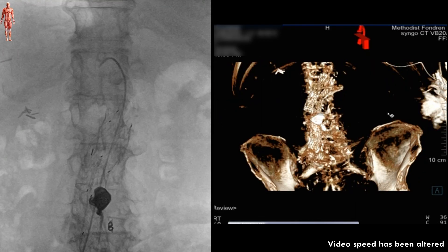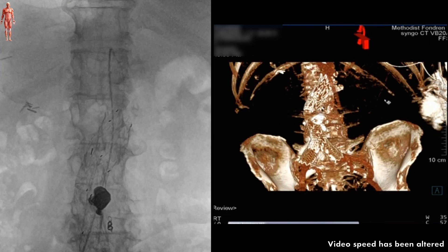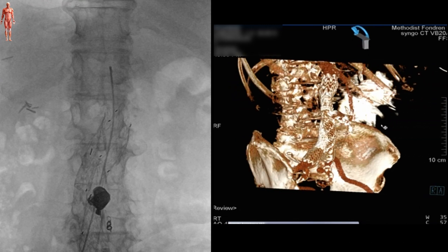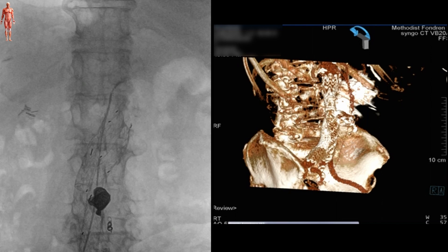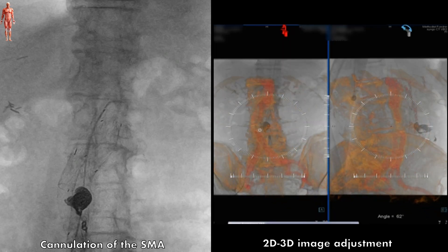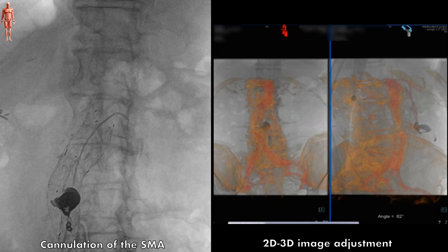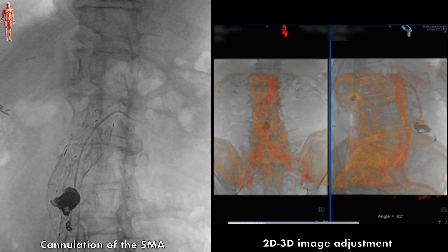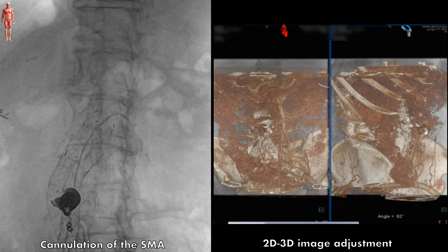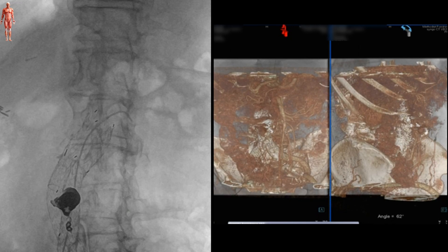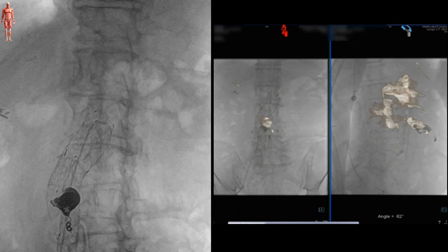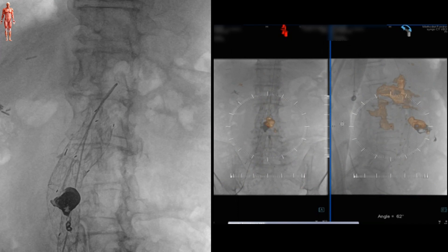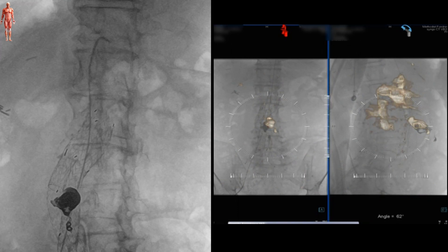After obtaining right common femoral access, we inserted our 5 French sheath and started with the cannulation of the SMA. This was aided by 2D-3D fusion imaging, meaning the patient's preoperative CT scan was overlaid and merged with the intraoperative fluoroscopy image. This was done by matching fixed anatomical landmarks like bone structures, such as the pelvis or spine.